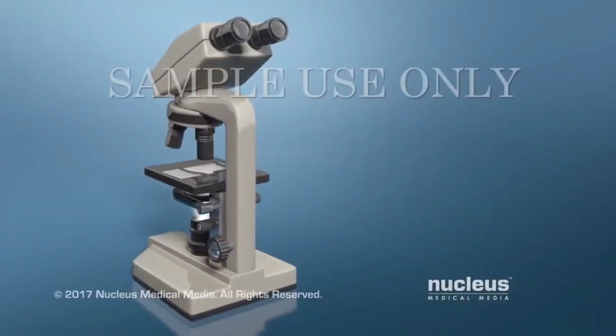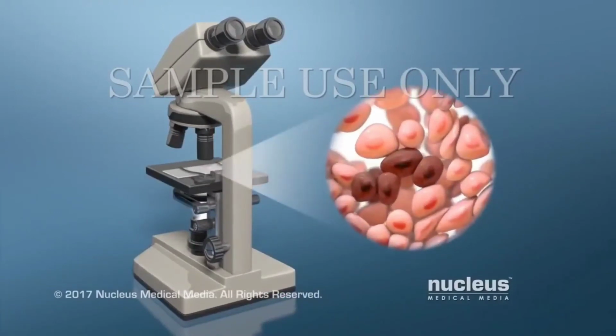Stain the slides and examine it under a microscope. Check for abnormal cells.